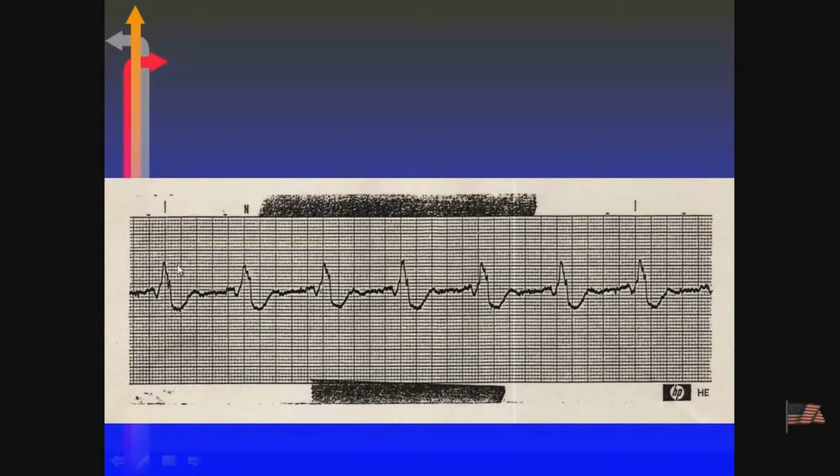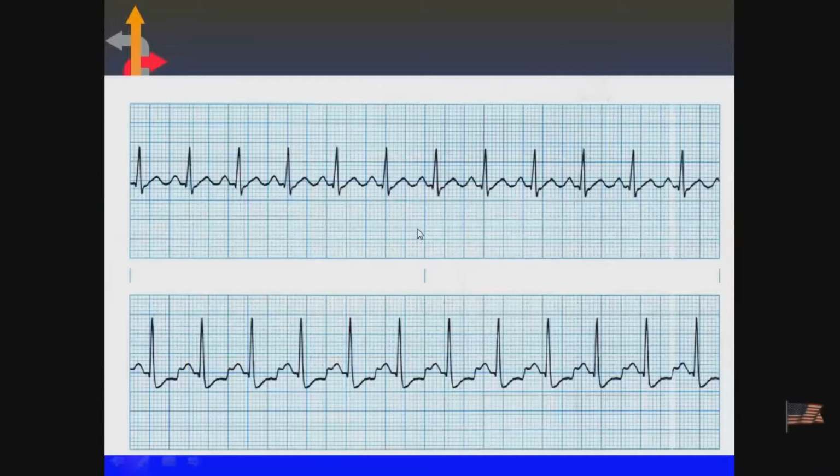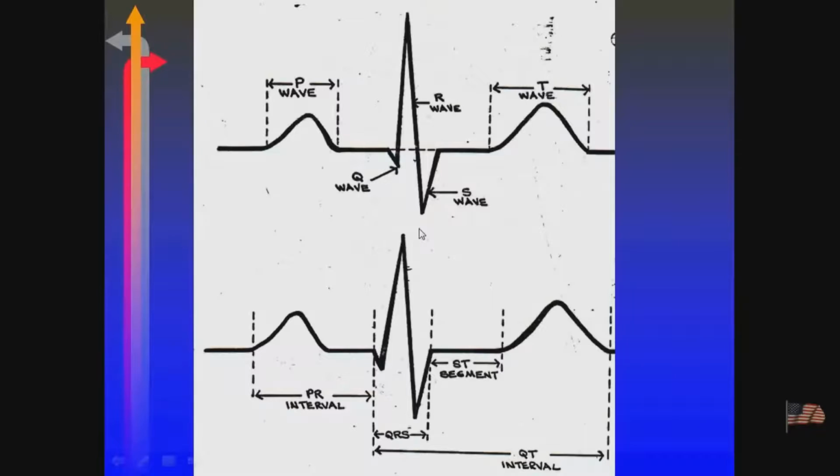If I were to go even further, 5, 10, 15, 20, 25 into 1,500, I think that works out to 60 also. But you basically are able to determine it. So I would feel comfortable giving you a strip and saying, what's the rate? Easy, right? Okay. And there's all kinds of ones that are out there, but we'll leave it go at that.